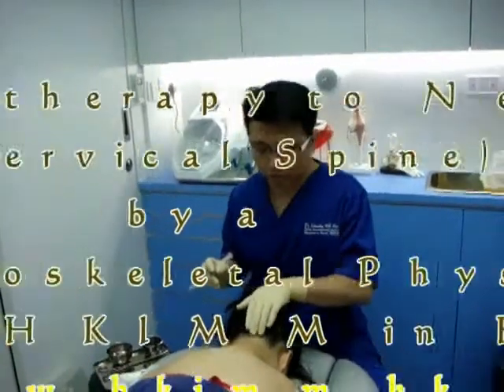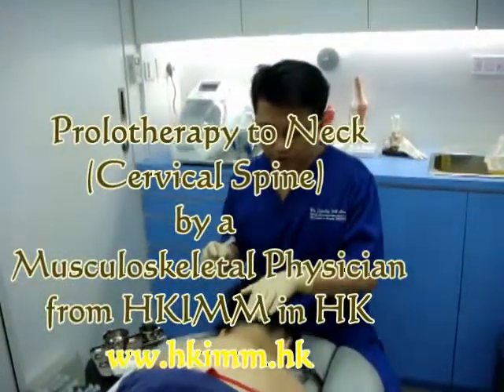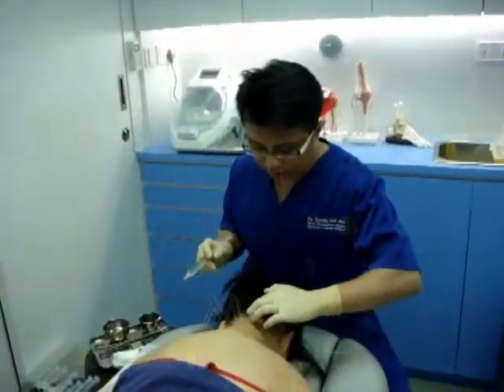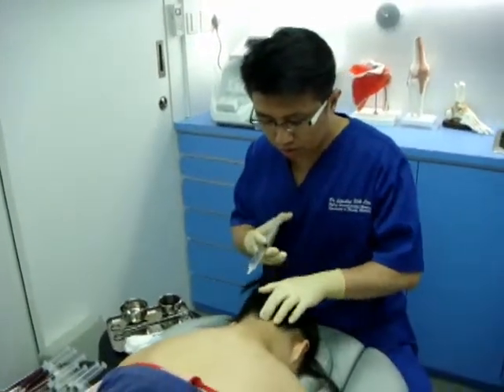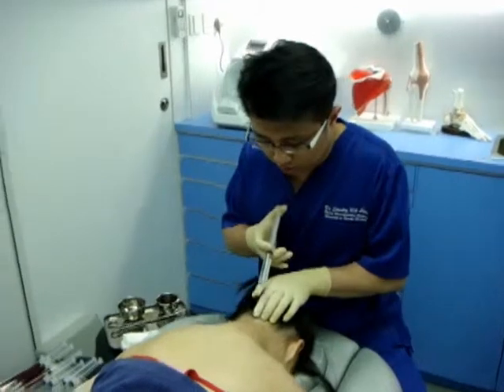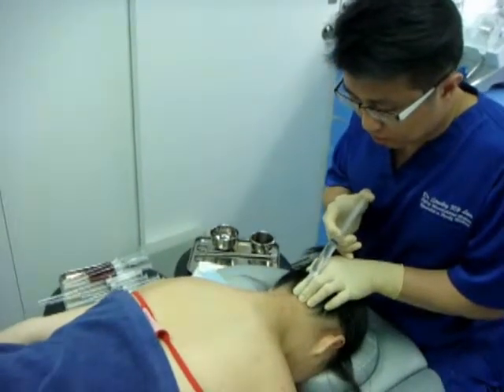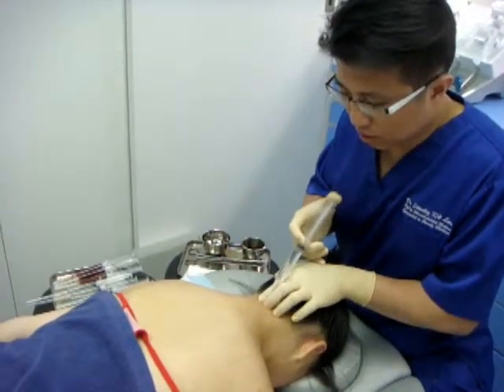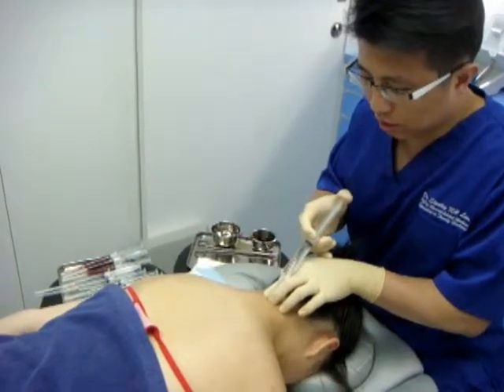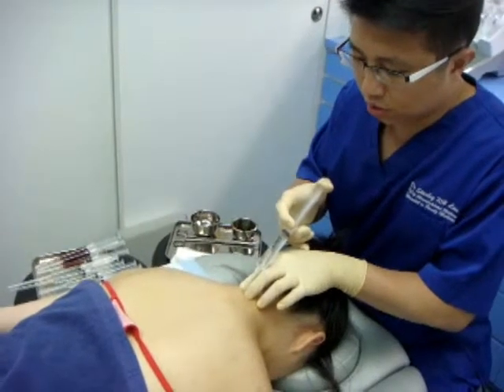Today I'm going to do prolotherapy for this lady's neck. First thing I'm going to do is apply some local anesthetics over the spine, over the region I'm going to inject.